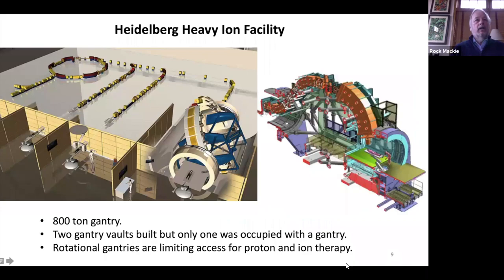That was until we hit the age of proton and particle therapy, especially carbon ion therapies, which are so expensive that ring gantries or rotating gantries for them are really questionable for making this field ubiquitous. In fact, the Heidelberg facility here did have room for two rotating gantries, and one of them was replaced with two conventional horizontal fixed beam lines. But you also see here that the patients are still being treated in the supine position using a robotic system for positioning.